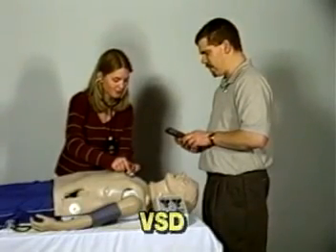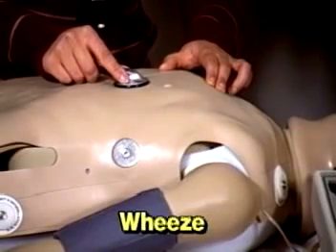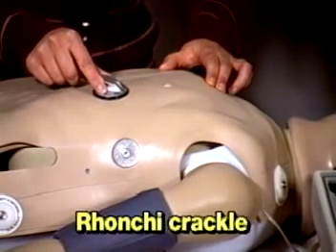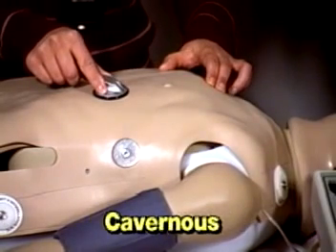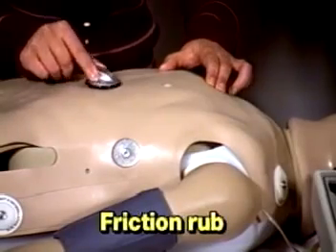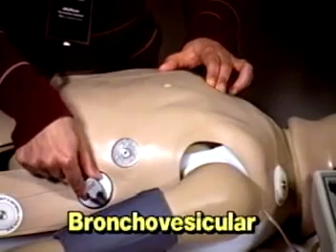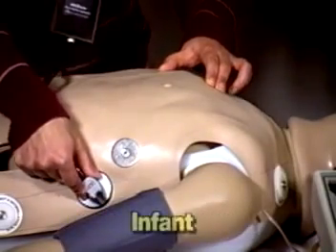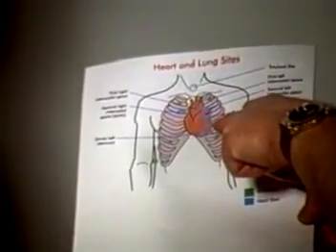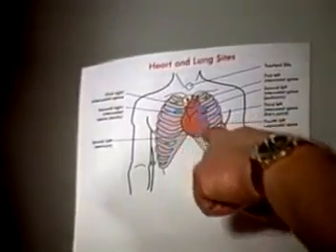The lung sounds that are simulated include normal sounds, wheeze, mono wheeze, fine crackle, ronchi crackle, coarse crackle, cavernous, bronchial, stridor, friction rub, pectoriloquy, egophony, pulmonary edema, bronchovesicular, and infant. There are six heart sites, five anterior lung sites, and two mid-axillary lung sites where sounds can be heard.